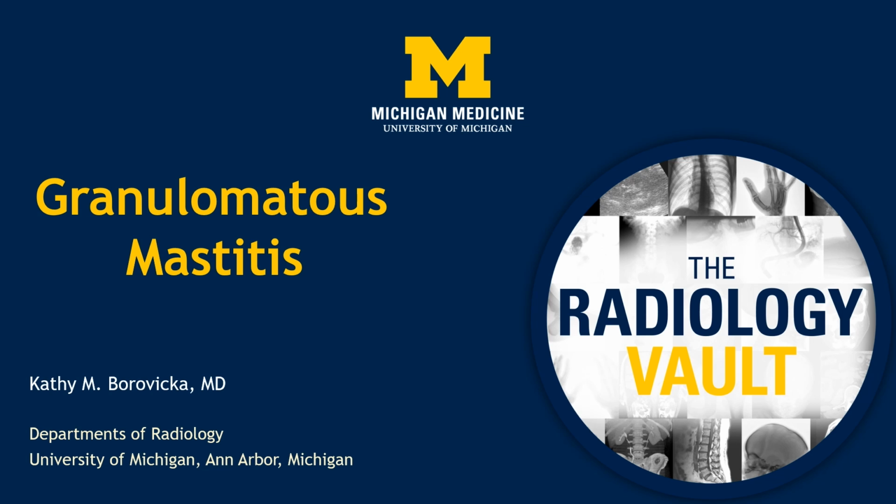Hi, my name is Kathy Borovicka. I'm one of the breast imagers from the Department of Radiology at the University of Michigan, and today I'm going to be discussing granulomatous mastitis.